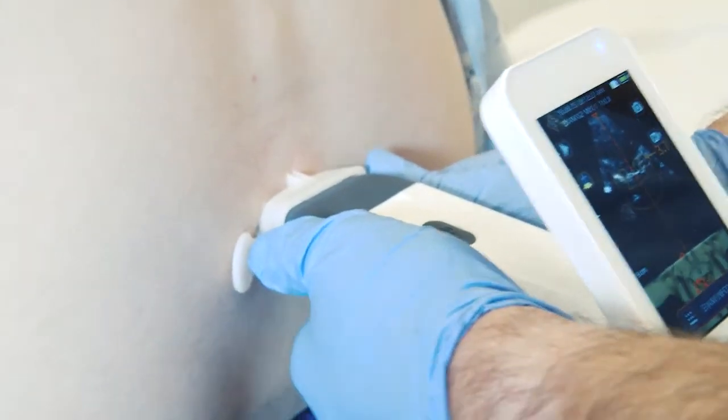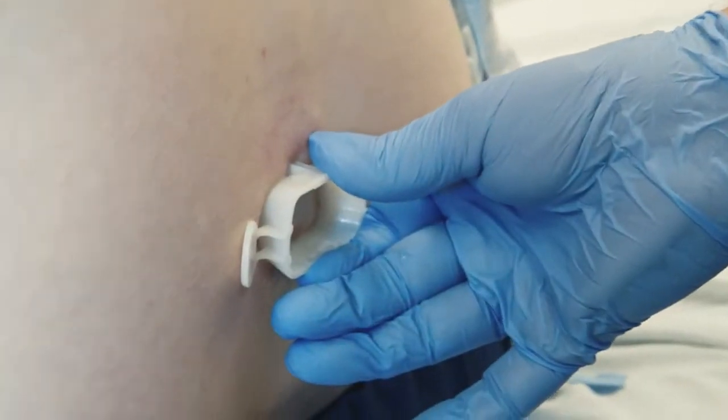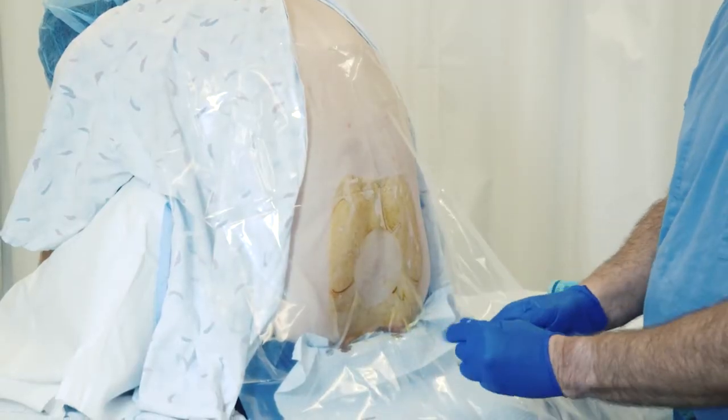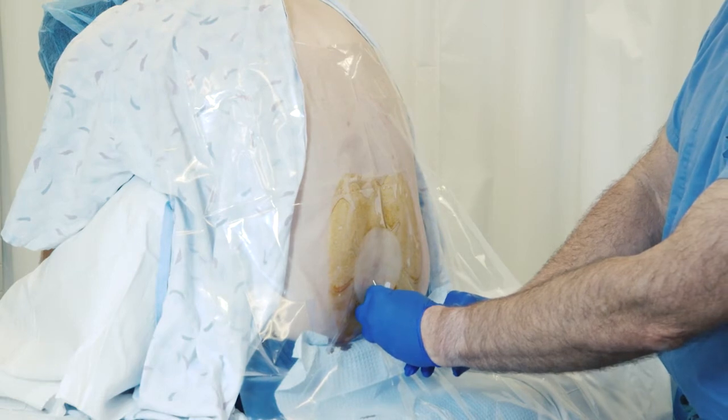Disengage the Accuro Locator Needle Guide and press gently against the skin to mark the location. If Accuro Locator is not used, then note the skin position corresponding to the middle of the transducer face using a preferred method, such as a surgical marker. Prep the needle insertion location and perform the injection according to standard protocol, recalling the depth conveyed in the SpineNav 3D scan.